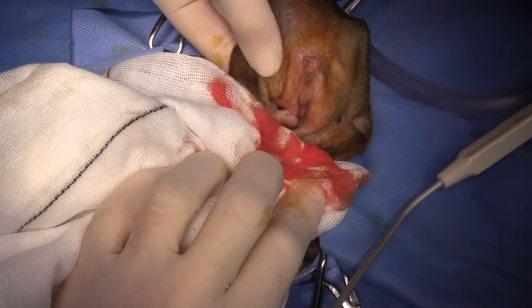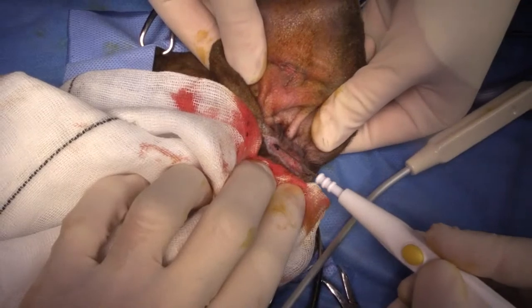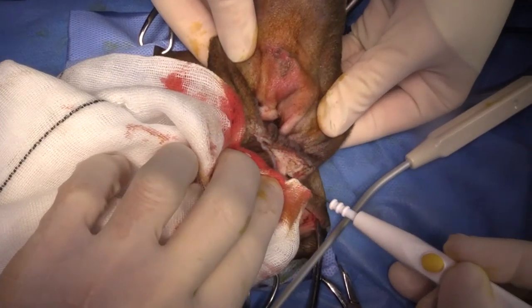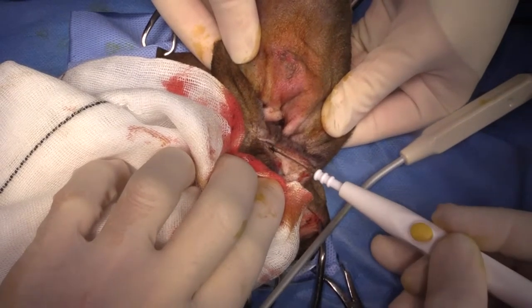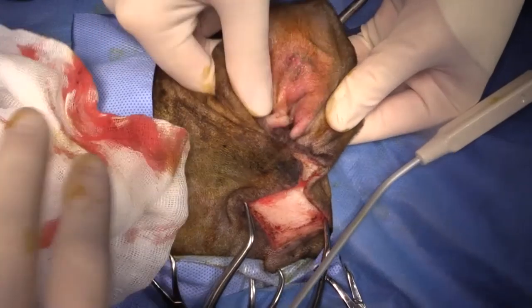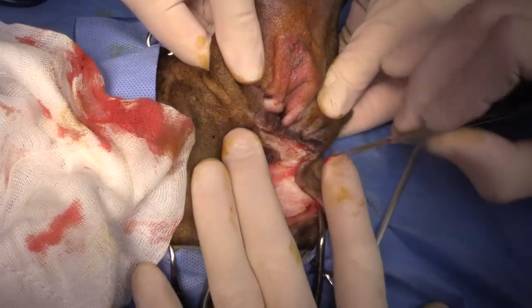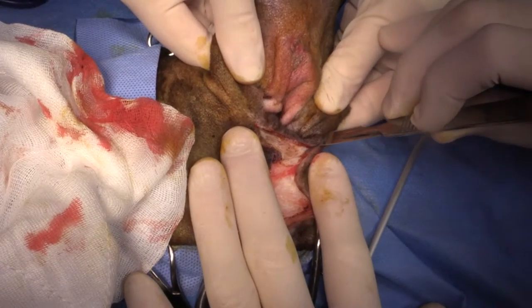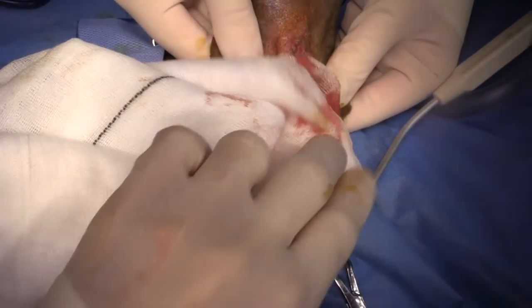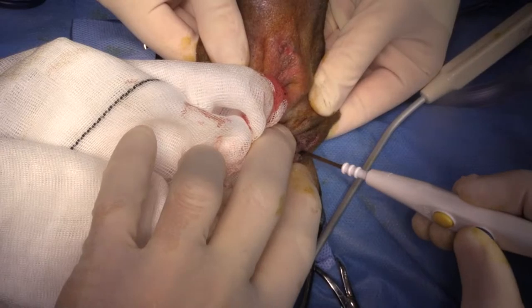I've done a few total ear canal ablations on this channel before, so you guys would have probably seen them, but for the newbies, I'll explain what I'm doing here. So it's absolutely critical to stay right on that cartilage of the ear canal to avoid hitting the facial nerve. Now, in this dog, I have the luxury that it already has facial nerve palsy, so we won't know whether it was my fault or whether it was just the disease.